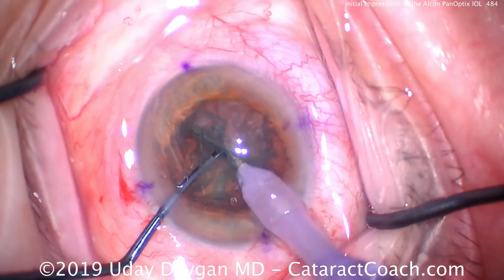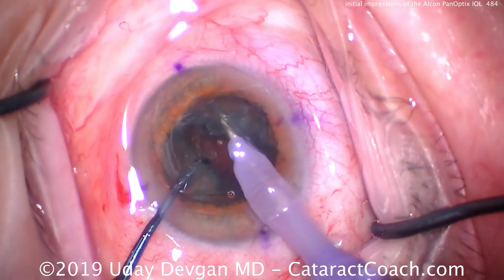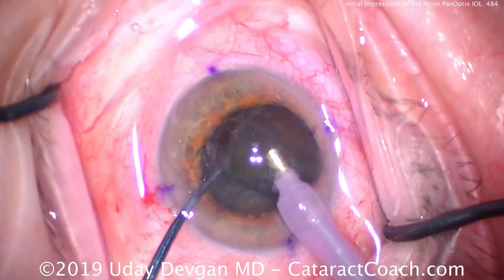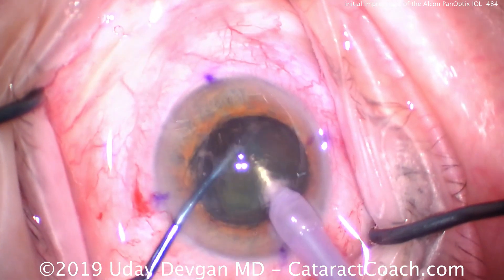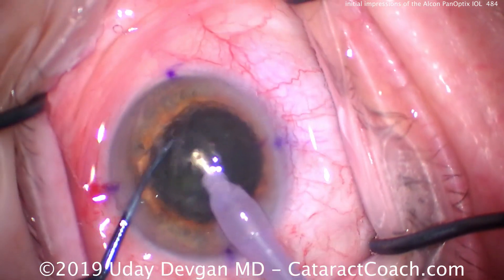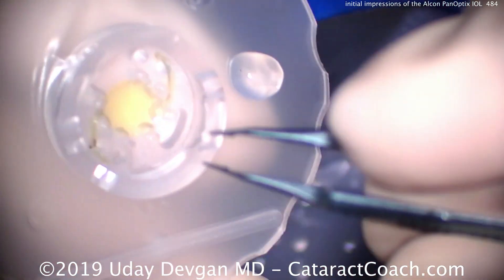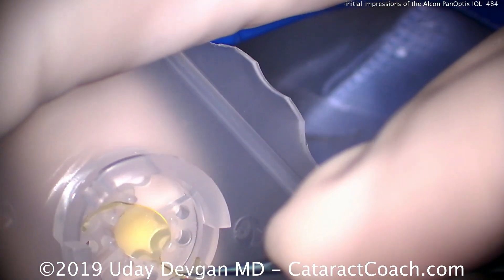Because this lens comes in both a toric version as well as a non-toric version, we're able to avoid using limbal relaxing incisions for the vast majority of patients. Let's fast forward and take a look at the lens. I'm going to load the lens myself in this case.